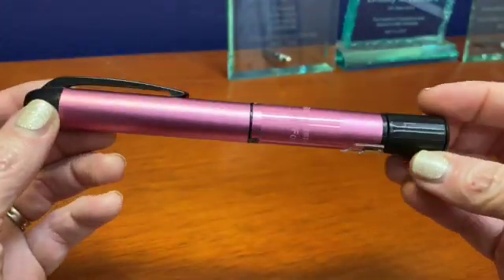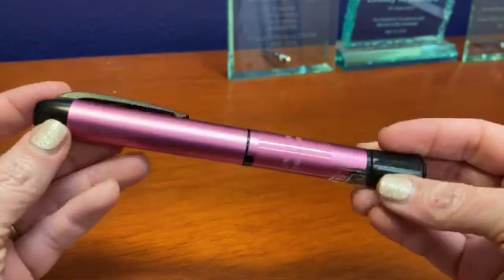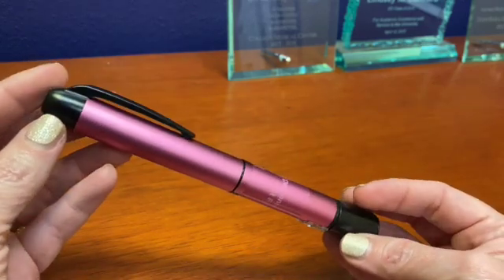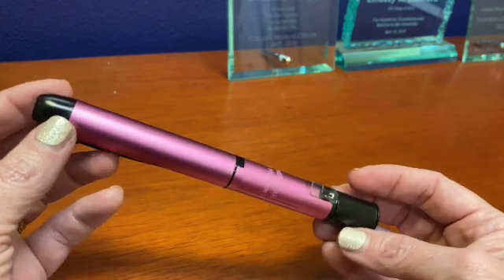Today we're going to talk about the InPen, a smart insulin pen that delivers mealtime insulin. Each InPen is designed to last for one year — it has a battery that lasts that long. Usually when we order an InPen for a patient, we'll get two of them: one for work and one for home, so you're never without your insulin pen.